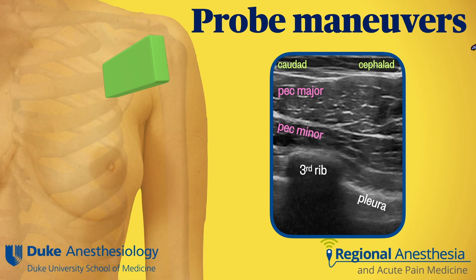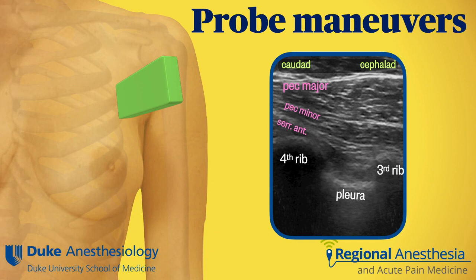This is the third rib. You can appreciate the fascial plane between the two PEC muscles here. This is the target for the PECS 1 block. The probe is then translated in the same inferior and lateral direction until the fourth rib is visualized.